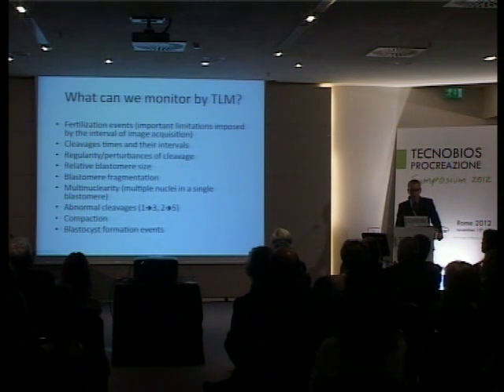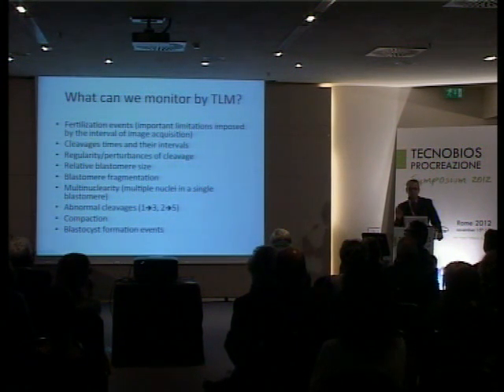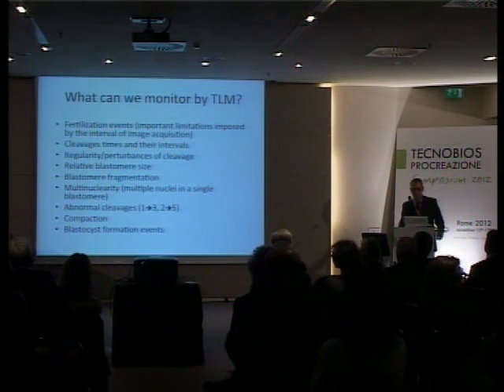So what can we monitor by time-lapse microscopy? What we've done with standard observation, but in a much more precise and detailed fashion. We can observe fertilization events with the delimitation we've just seen in the previous videos.